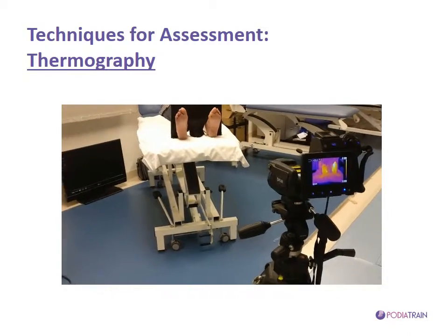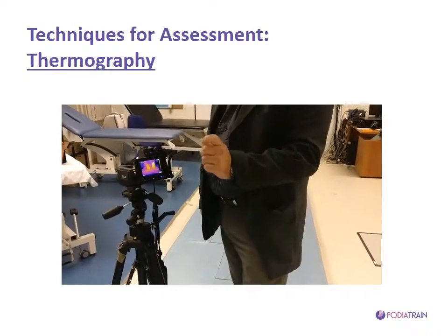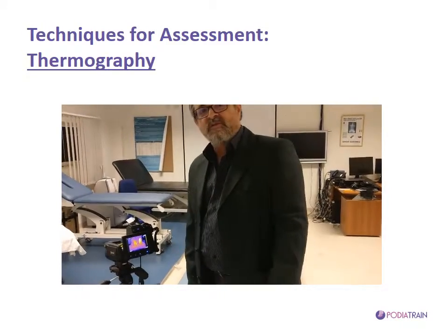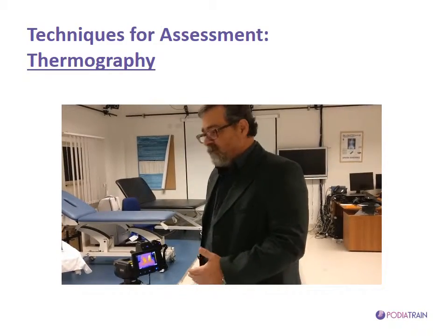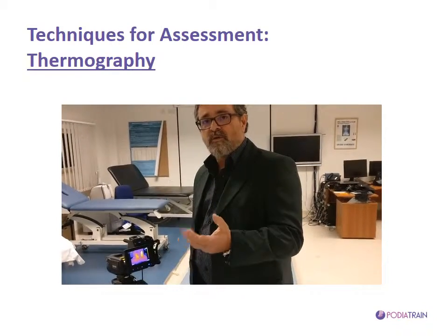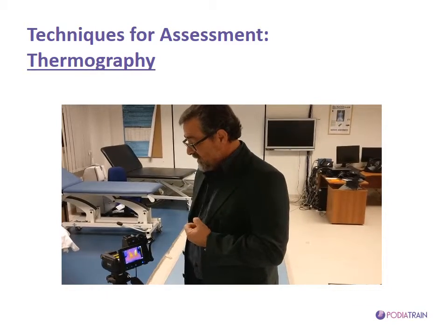We know that any object above absolute zero emits heat, and this is the infrared part of the wavelength, which is measured using this special apparatus, known as a thermal camera. During clinical examination, we normally assess the patient's foot for whether it is cold or hot, because we know that heat gives us very good and important clinical data.